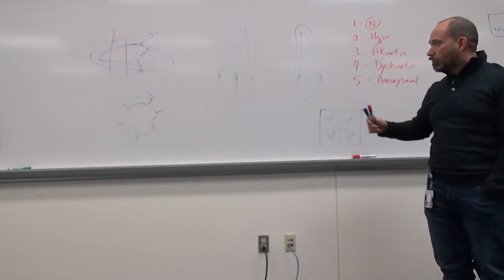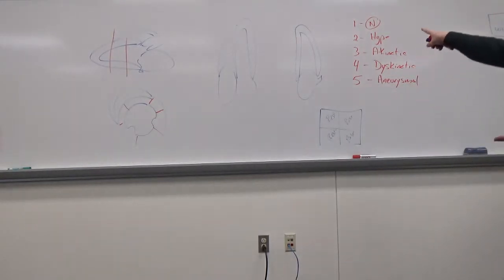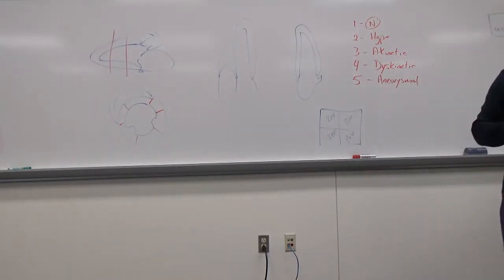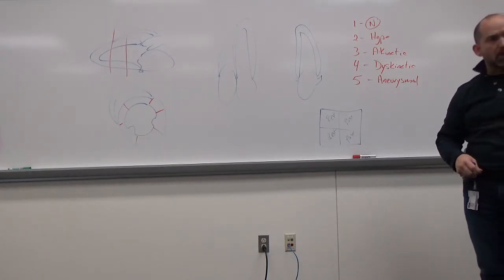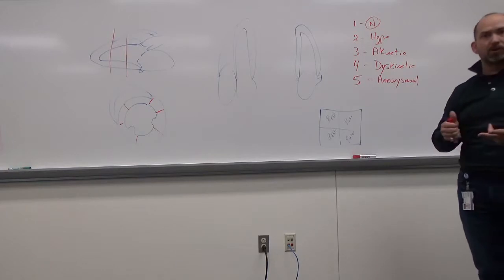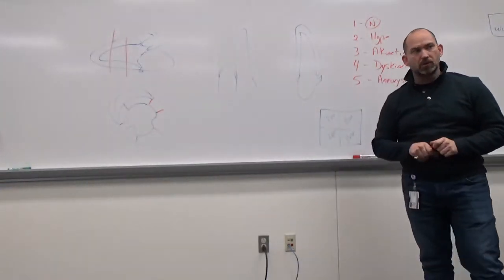Okay? So wall segments are going to be important. Being able to grade them is going to be important. Knowing the types of stress tests, we talked about exercise versus pharmacological. Dobutamine is the most common pharmacological. What types of exercise stress echo do we have available?